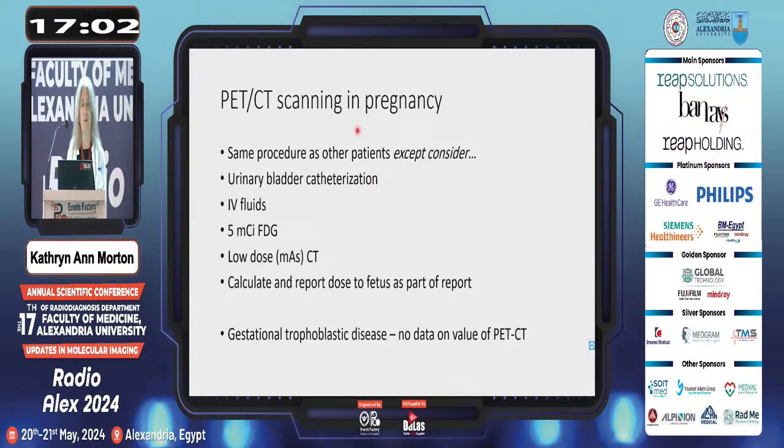It is also important to calculate and report the dose to the fetus as part of your report, just for your own medical legal protection when you're doing these studies. Now, for gestational trophoblastic disease, there's no data on the value of PET-CT. I have found nothing in the literature, and I've never seen a case myself.